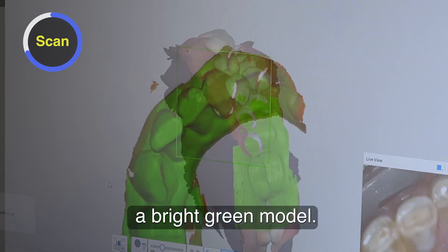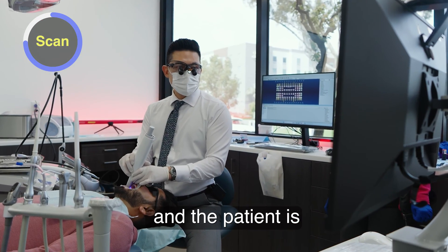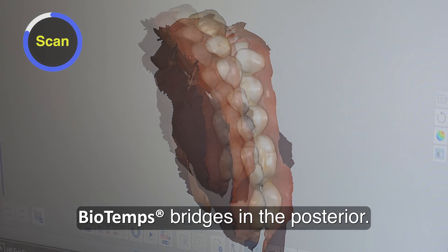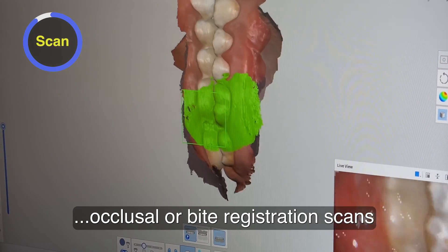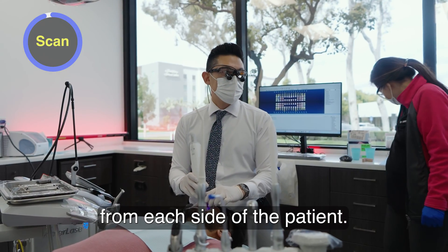Of course, we finish off with the bite scan, and the patient is at their new vertical with those biotemp bridges in the posterior. So with a full arch scan, you can take a couple of different occlusal or bite registration scans from each side of the patient.